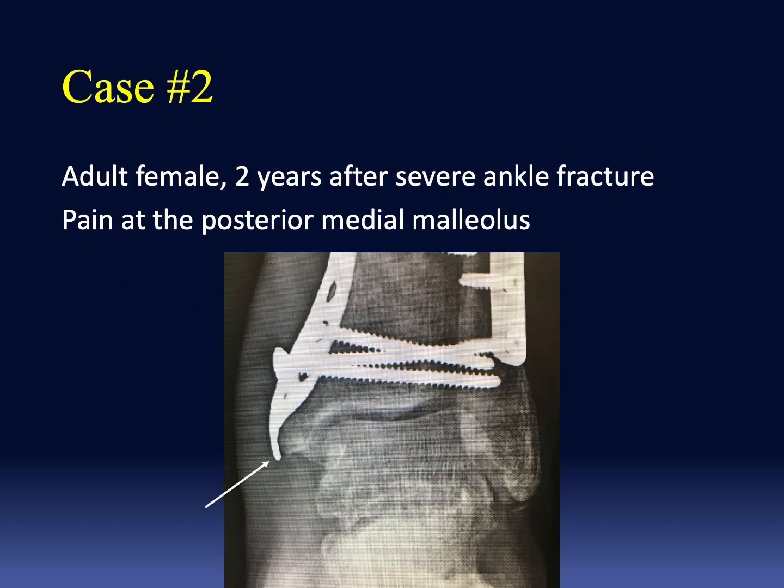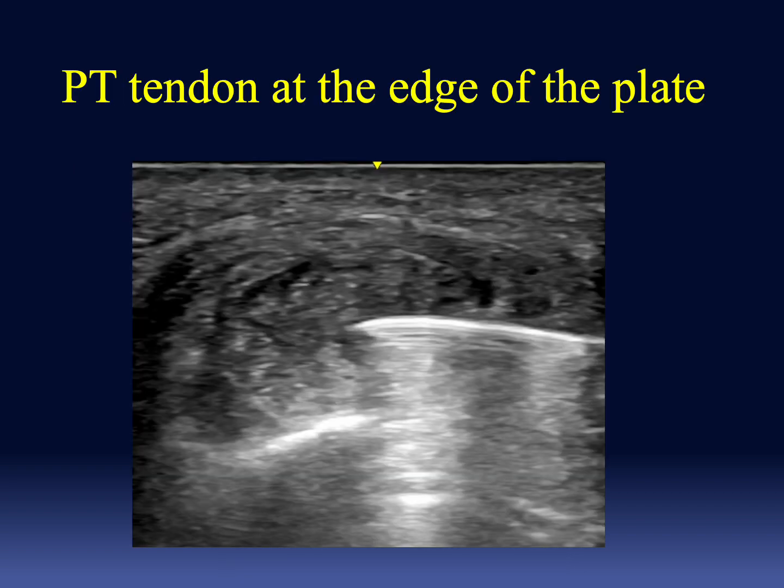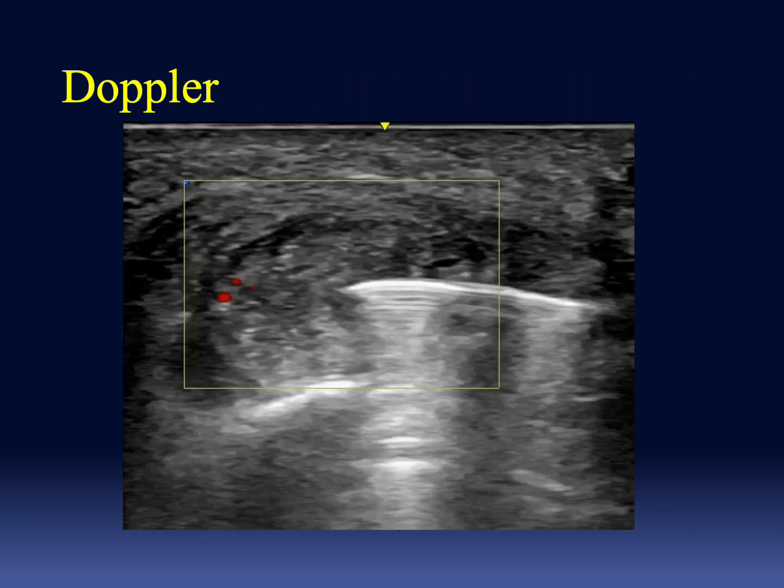The second case is an adult female who is more than 2 years status post ORIF of a severe ankle fracture, and she comes in with pain at the posterior medial corner of her ankle, near the point indicated by the arrow, but more to the posterior side of the metal. Here is a static view with the metal plate, the bright white line to the right, and a somewhat less echogenic tendon to the left, being deformed by that metal.